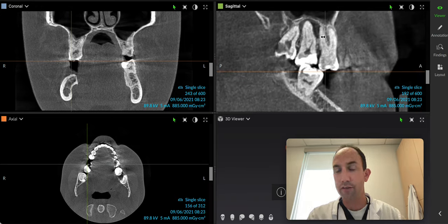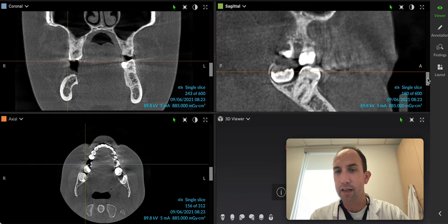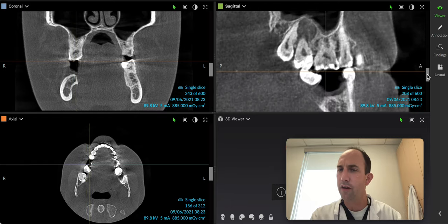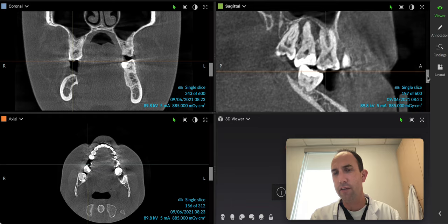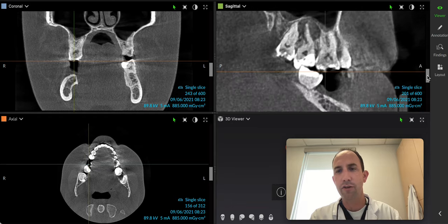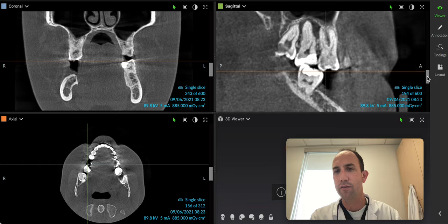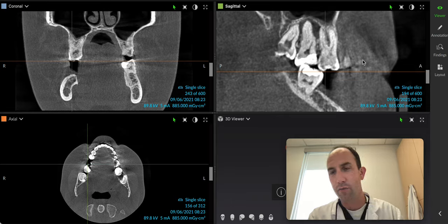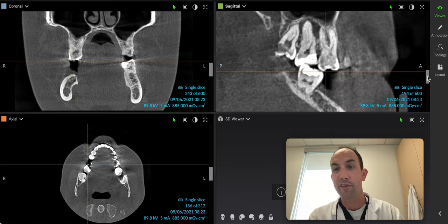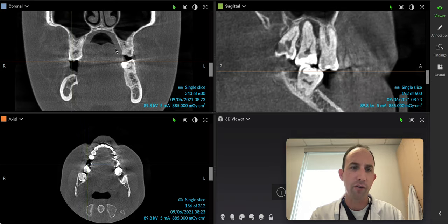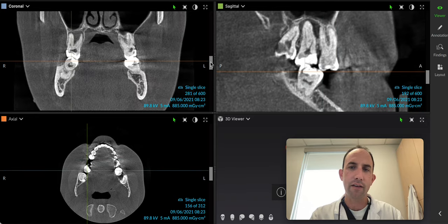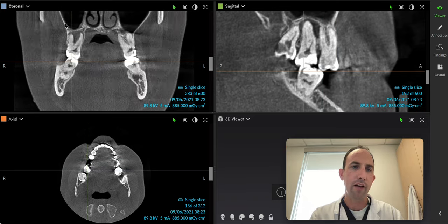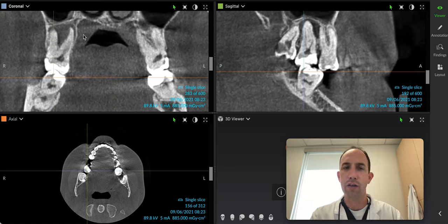So I would encourage you, if you have access to a 3D X-ray machine, to always take a 3D in lieu of a panoramic on adult patients if it's indicated, primarily because it gives us so much more information — just a tremendous amount of information. For her, we've already recommended the wisdom teeth extractions, root canal through the crown with a composite, a crown and a core buildup with a root canal on tooth number three. It's going to be a busy day for her. That should really be a shout-out to the diagnostic capabilities of a 3D machine.